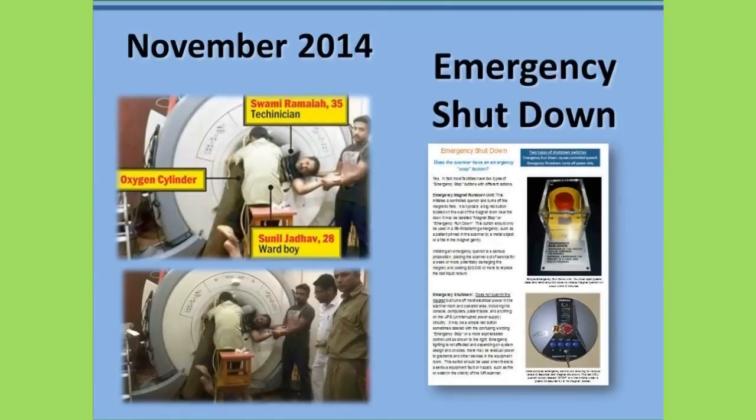This emphasizes that MRI facilities must have policies and procedures in place to quickly respond to accidents involving the missile effect, including having proper guidelines to follow regarding quenching the magnet in the event that an individual gets stuck between a large ferromagnetic object and the scanner.